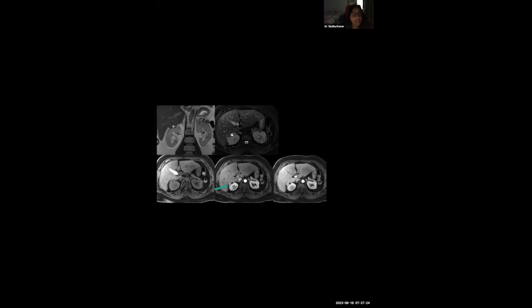If we had seen this lesion in the uterus, there is no confusion that we would call this a leiomyoma. So this was a biopsy-proven classic renal capsular leiomyoma, an unusual case we sometimes have. So in summary, renal masses have very distinct features on multiplanar MRI, which will help us differentiate between common and uncommon pathologies, malignant and benign etiologies, and that helps with effective management options.